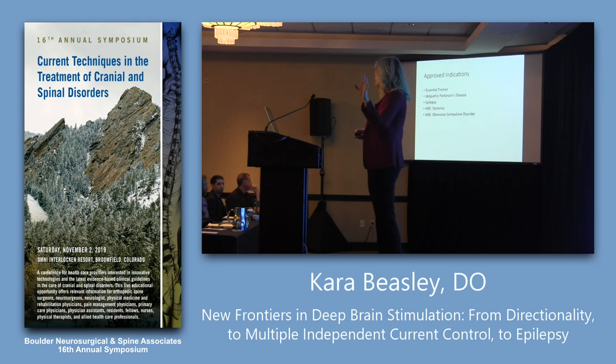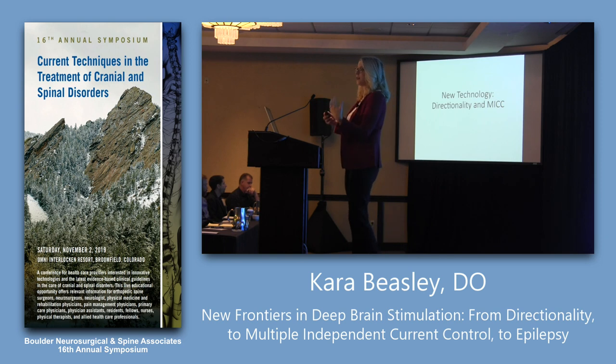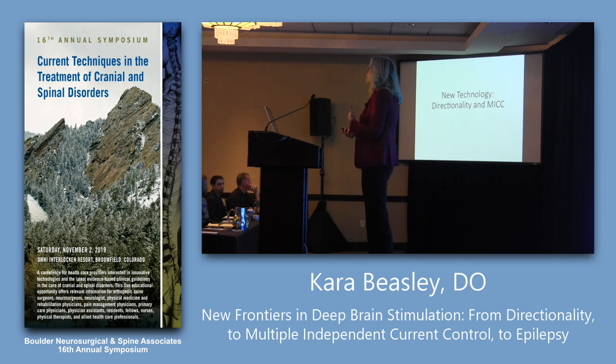I've talked to you about the things coming down the line last year and the year before and the year before that, so I'm not going to go there. But I want to talk to you specifically about the devices themselves, because a couple of things have changed. In particular, we now have what's called directionality, or directional leads, and something called MICC, we love these alphabet soups, multiple independent current control.